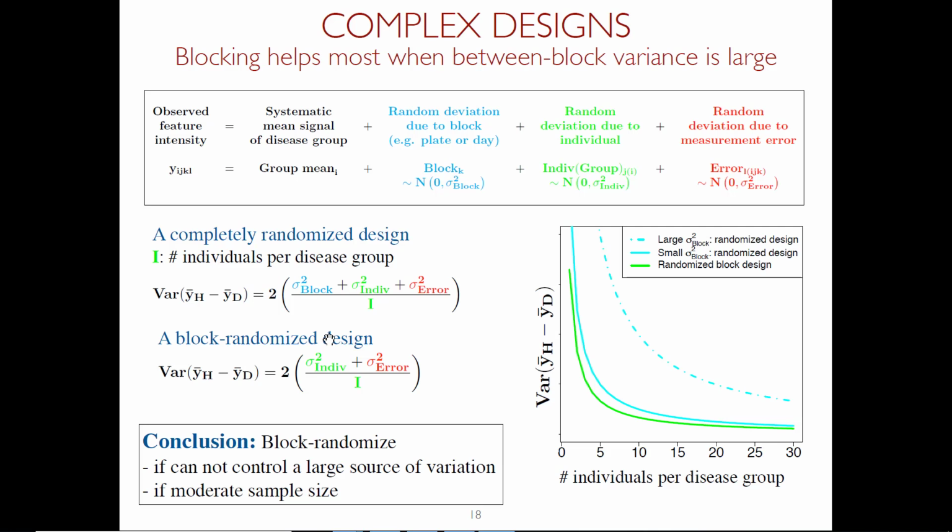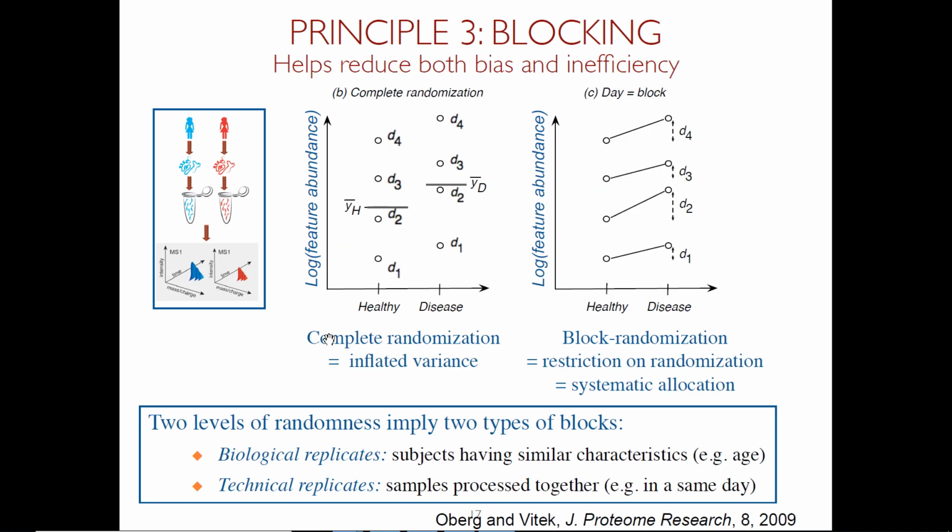Okay, let's see. So I'm wondering for the block variation, how do you calculate it? Do you use all the samples, like in day 1 and in day 2, or can you use a QC pool to calculate the... No, you use it from the data. So what you do is kind of the same way as you would have here.